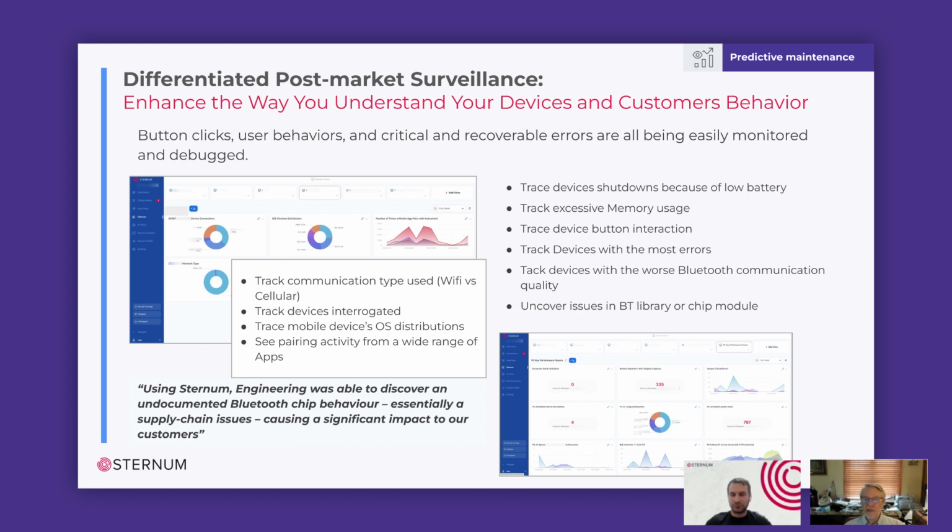Another thing with the memory usage that can be really useful to embedded developers is in our RTOS environment, we have a stack for every task, and those stacks are a fixed size. And during development, you have to ensure that that stack is big enough to handle the worst case utilization of anything that that task is responsible for. And so what we try and do is aim for a reserve of 20%, that we want to see the maximum utilization of that stack to be 80%.